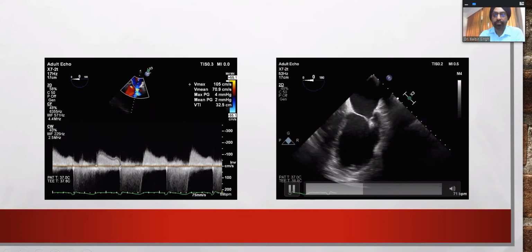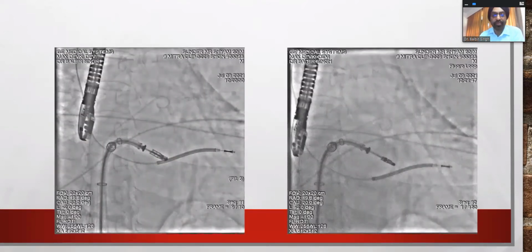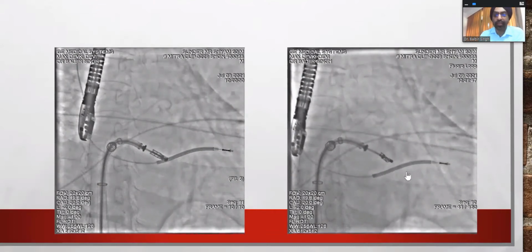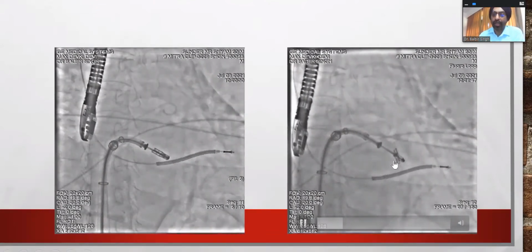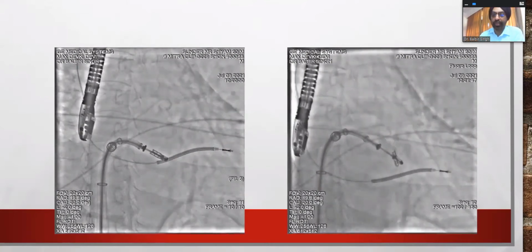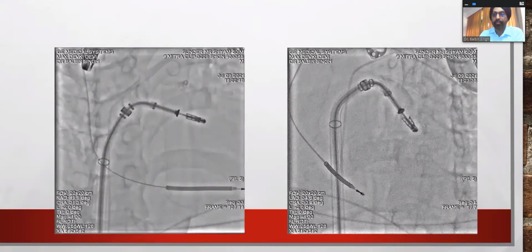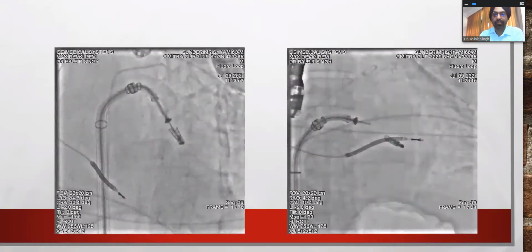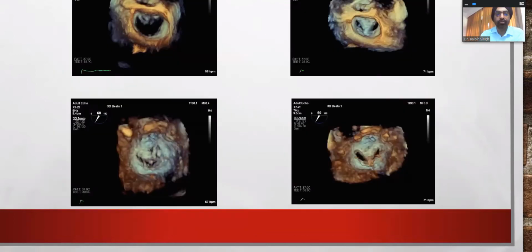And now comes the release. Release is also a very integrated process. So this is the clip lying in the left atrium. This is the clip which is open. So you have to position the clip before it enters into the LV. You have to make that position before it enters the LV. And how do we make that position? This is the clip being released and having been released. So how do you make that position?